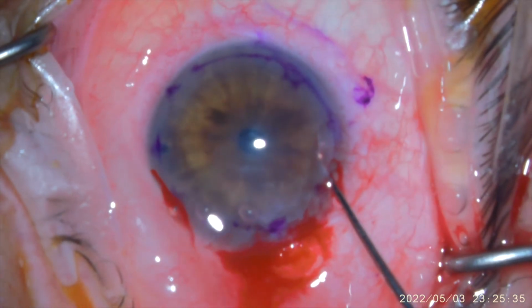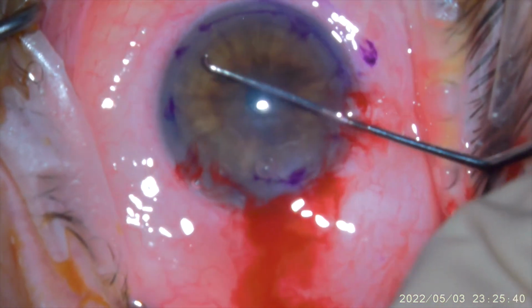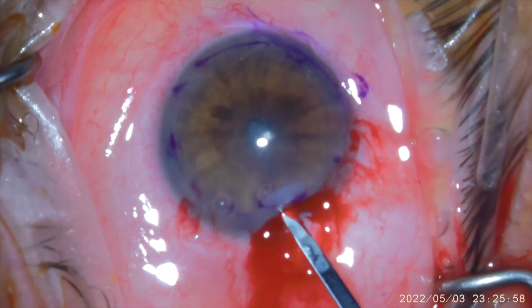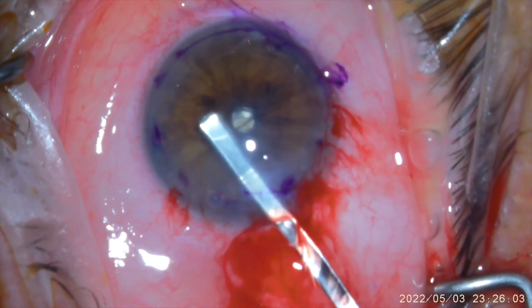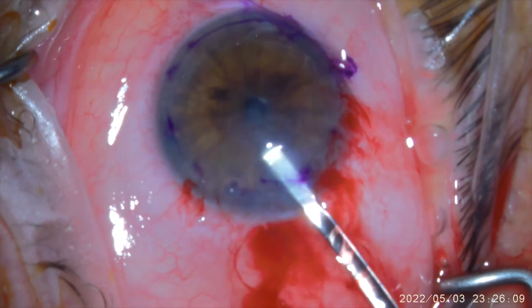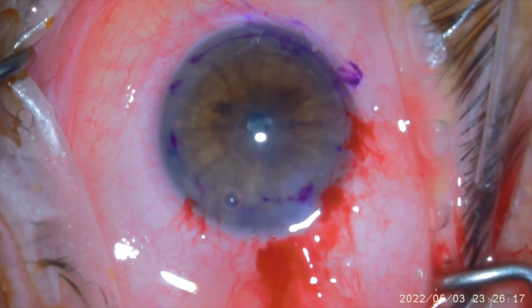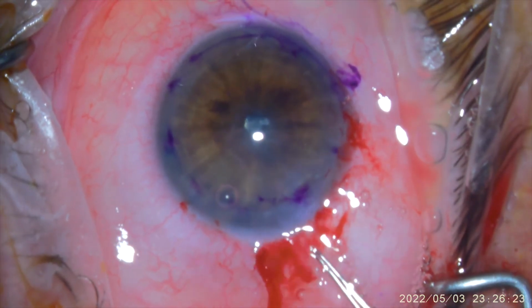I then will go across the eye and try to peel back the Descemet there, and to create a starting point for my scraper so I can more easily go back and forth to peel back Descemet's and the old endothelium that is now compromised, in this case of pseudophakic bullous keratopathy. I then use a forceps, Descemet forceps, this one's made from Rumex, and I've taken out the Descemet's, and in total, you can see that as I spread it there on the cornea.